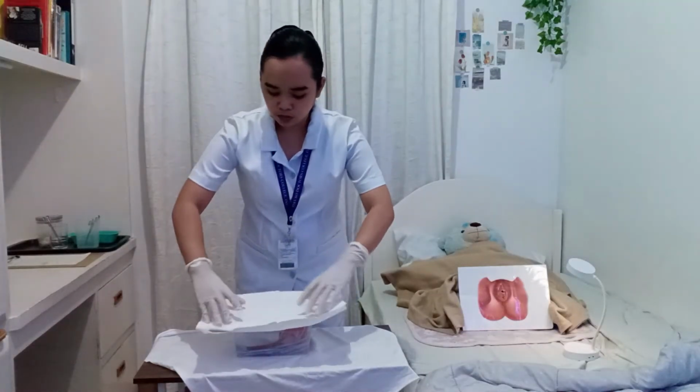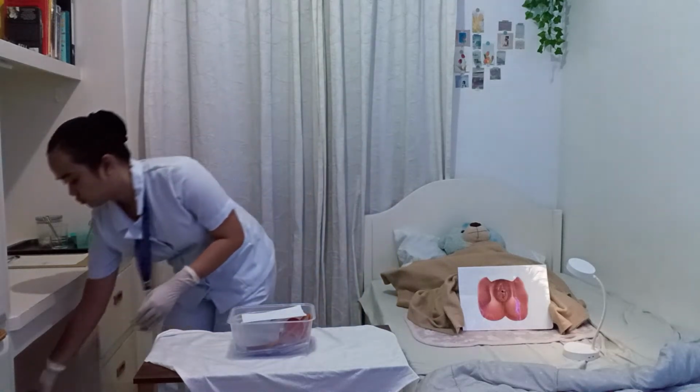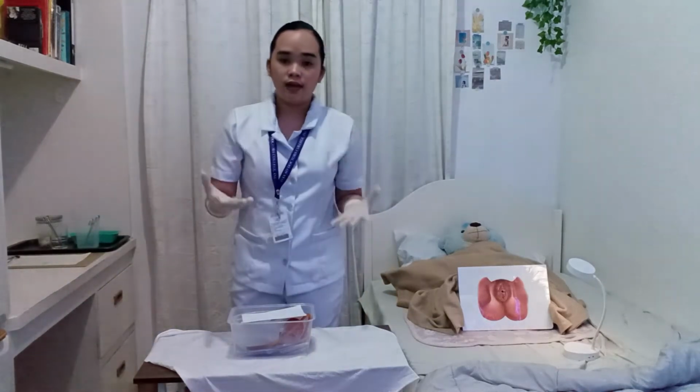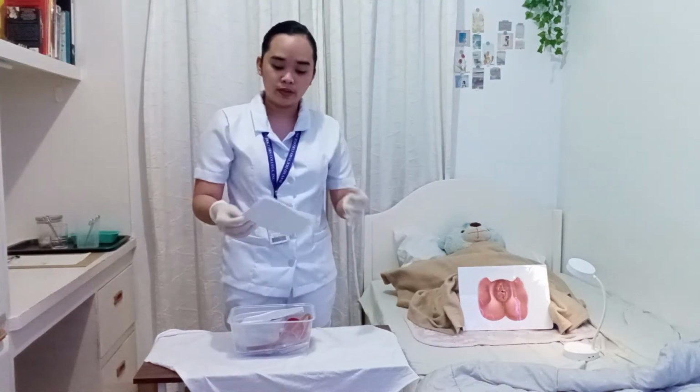Okay, and I'm going to discard this wrapper. Okay, and now I'm going to place the absorbent pad and the eye sheet over the patient's perineal area.